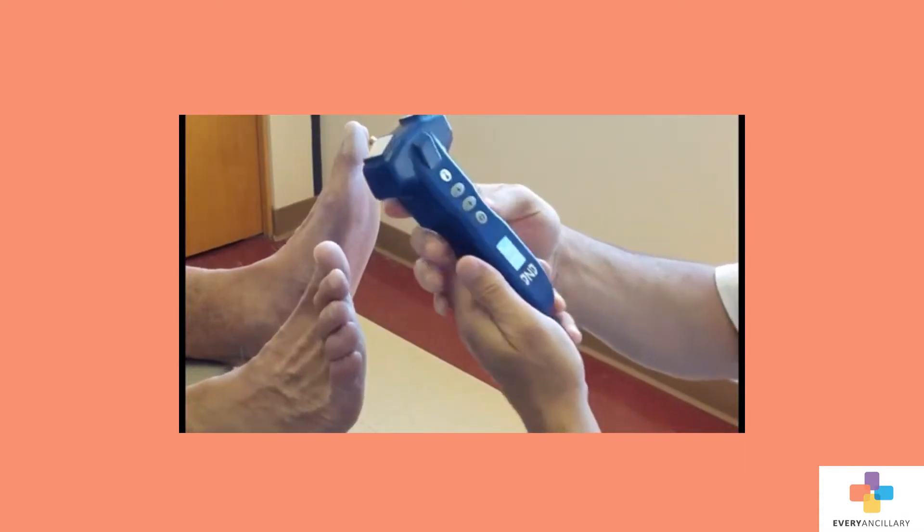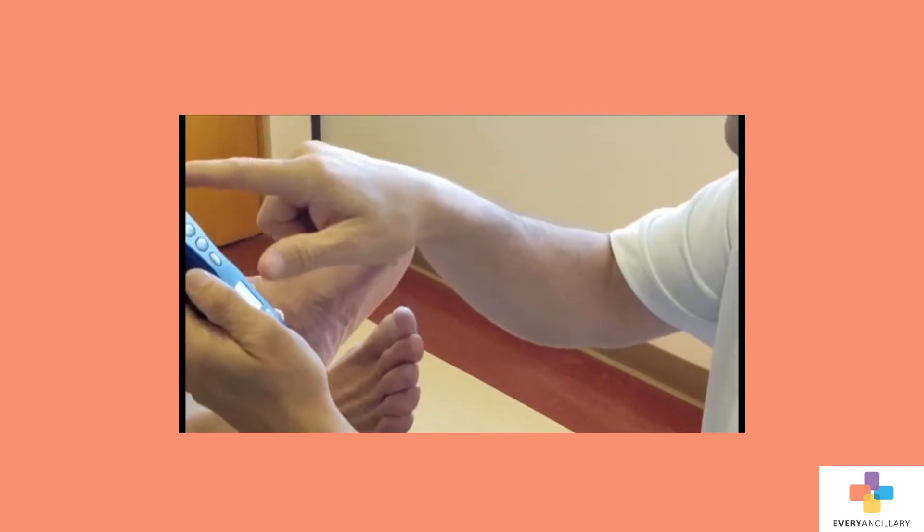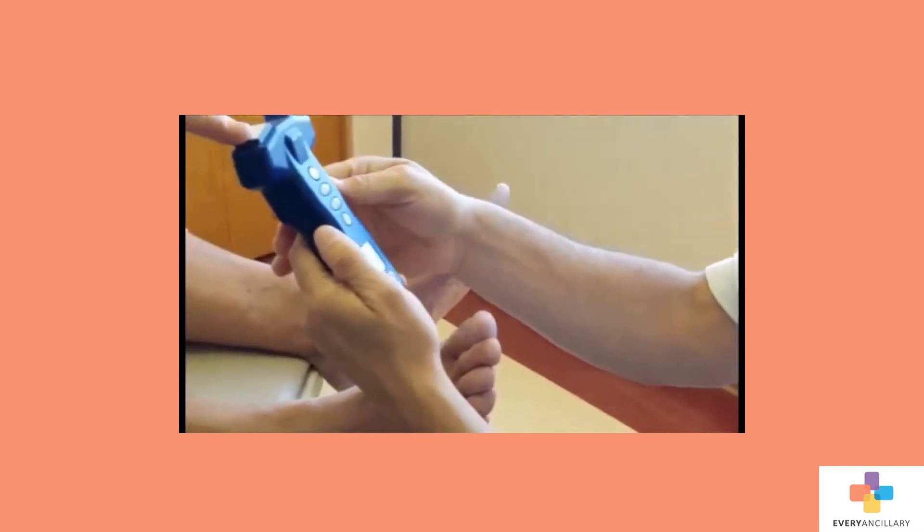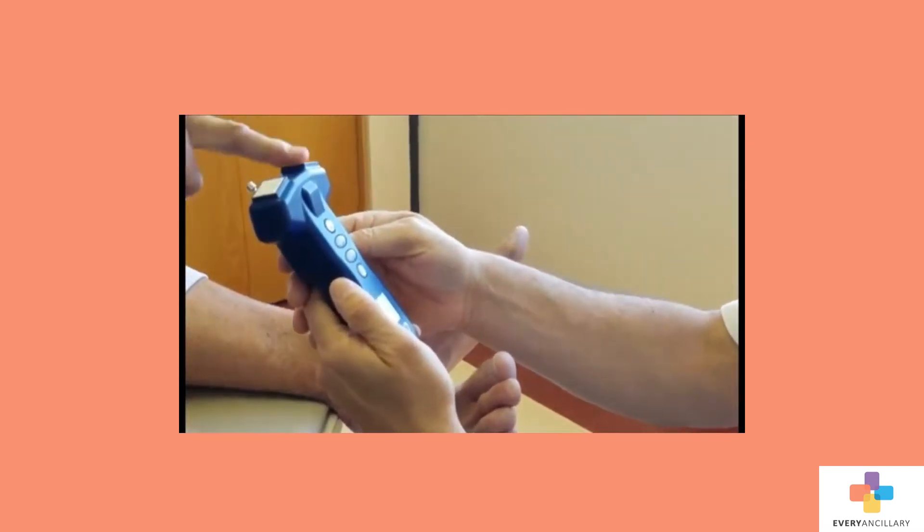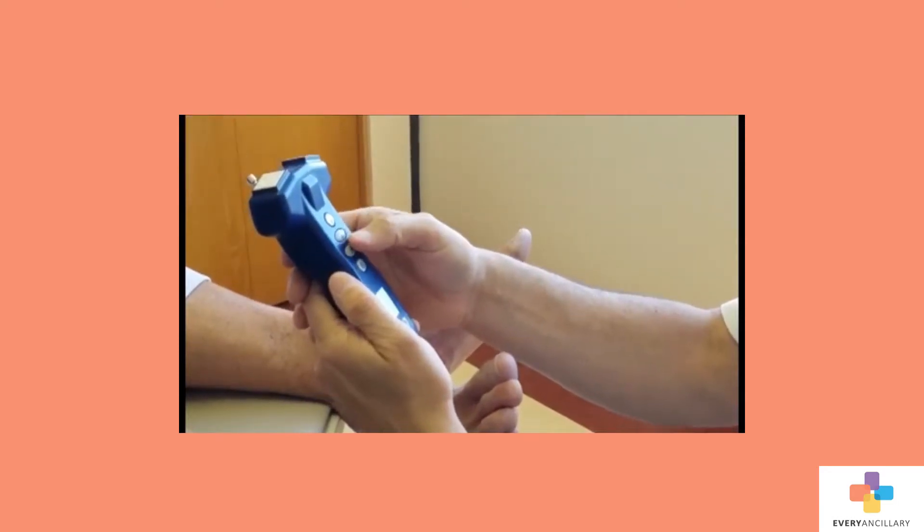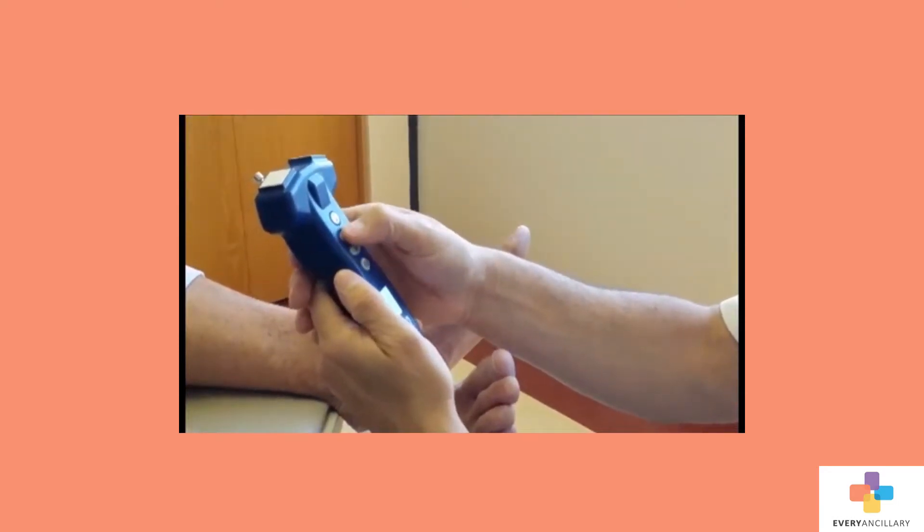Okay, please bring me your finger, your index finger. Put it on one pad, and then the other. Can you feel the difference? Yes, I can. The patient feels a 6 degree difference.